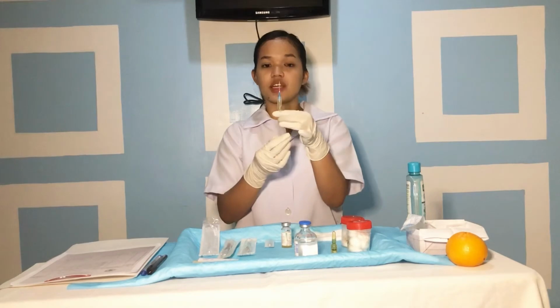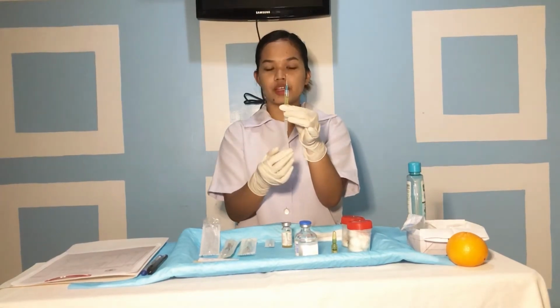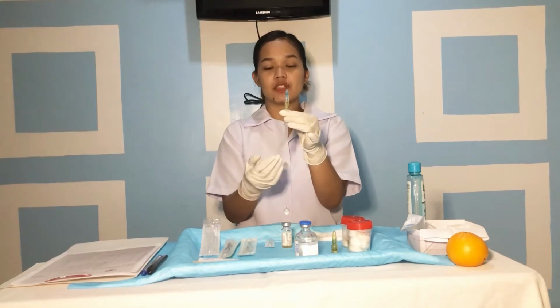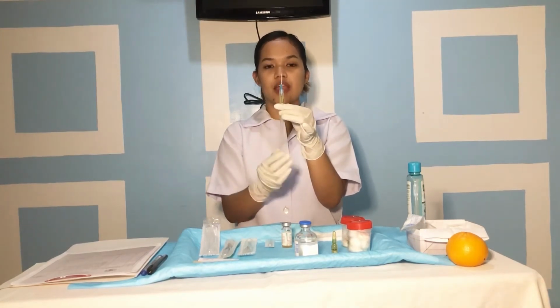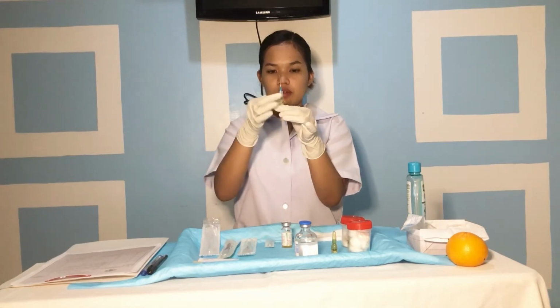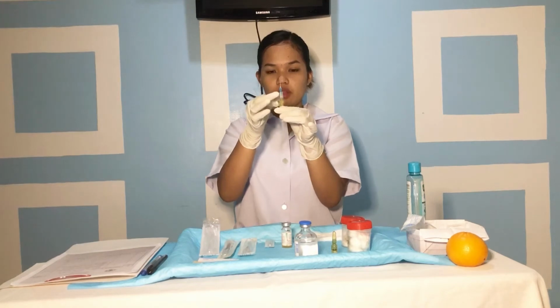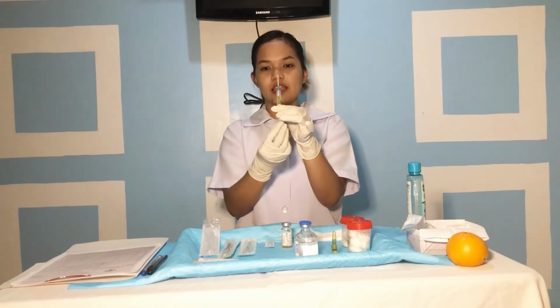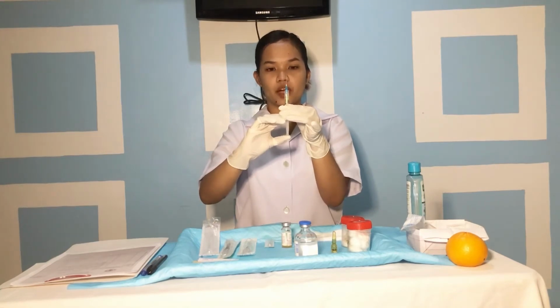We hold the syringe at eye level, at a 90-degree angle, to ensure correct volume and absence of air bubbles. Remove any remaining air by tapping the barrel to dislodge the air bubble. Draw back slightly on the plunger and push the plunger upward to eject air.